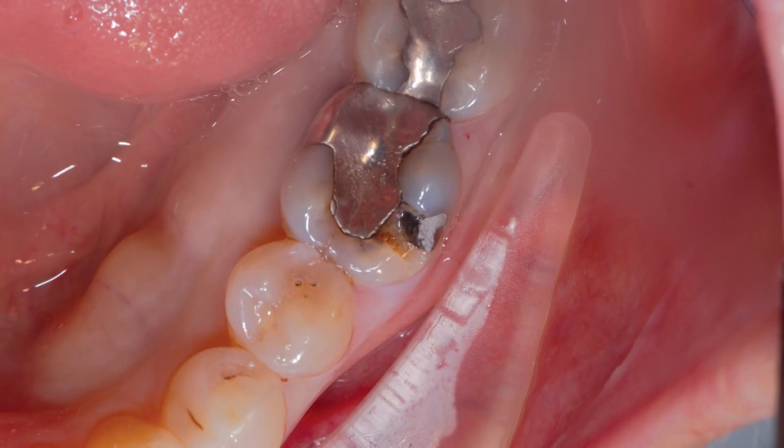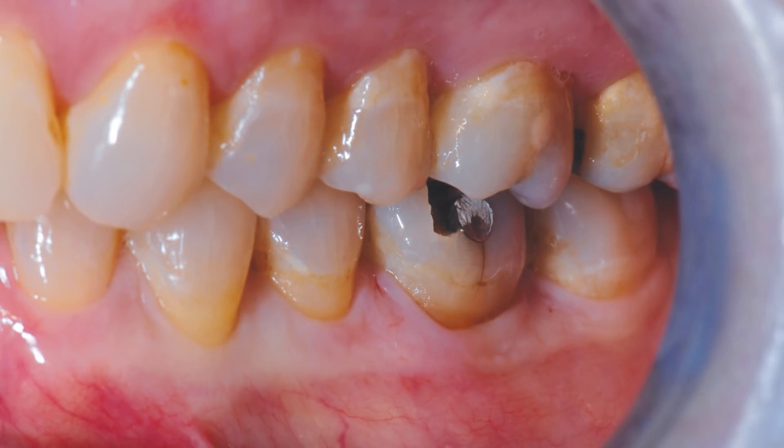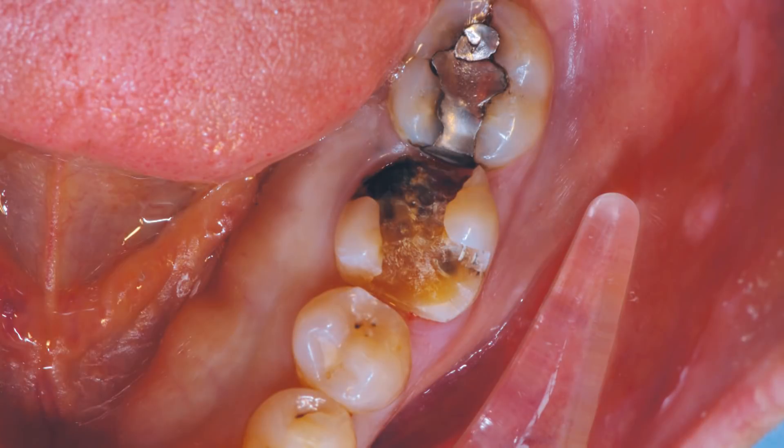The initial condition of the patient whose mandibular first molar suffered from a cusp fracture and lost marginal integrity of a large amalgam restoration. The patient had a missing portion of amalgam on the buccal that, in combination with some dental caries, had necessitated restoration with a full coverage crown. Because the patient wanted to receive the crown as quickly as possible and the restoration was a single unit in the posterior, Bruxer Now zirconia was the ideal restorative solution.